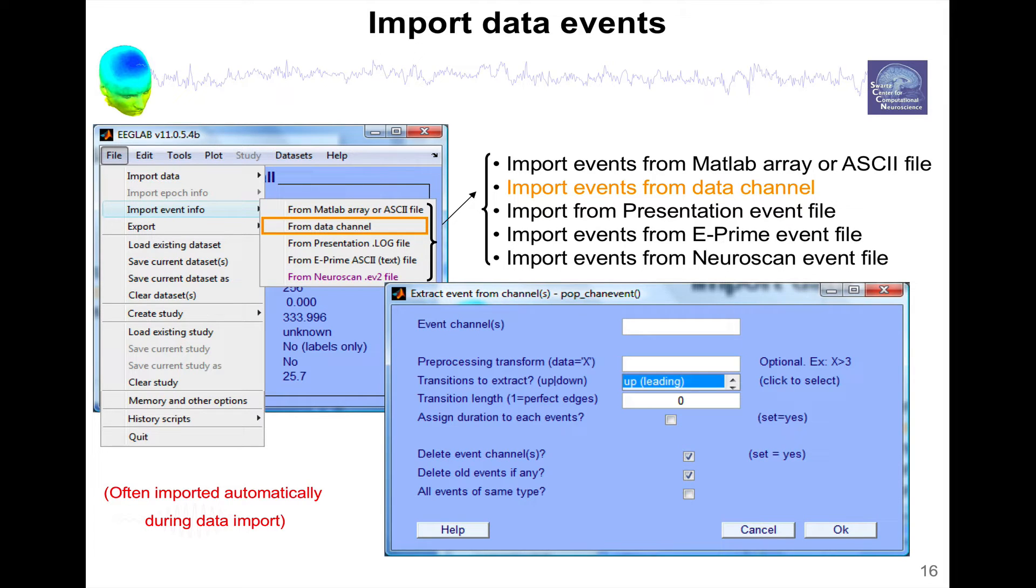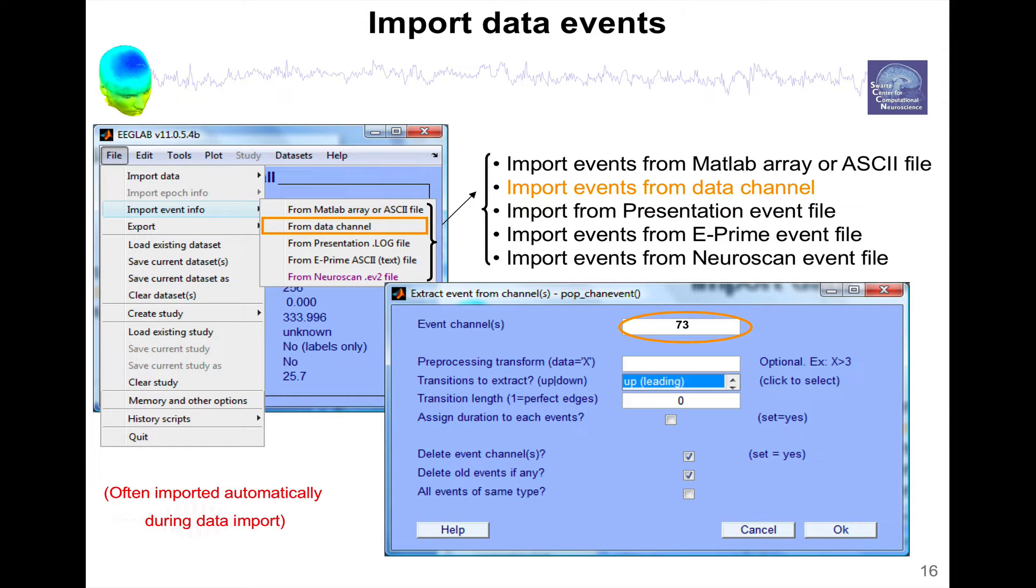So if you call this menu here, it's going to ask you what's the number of the event channel. For instance, it could be 73 here. That's usually the last channel is the event channel.